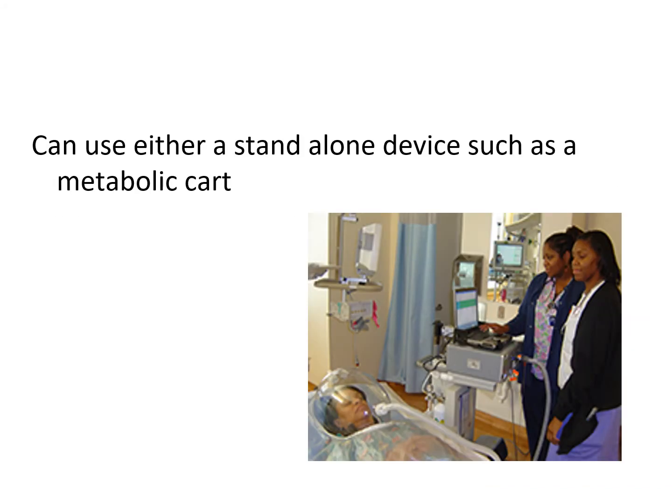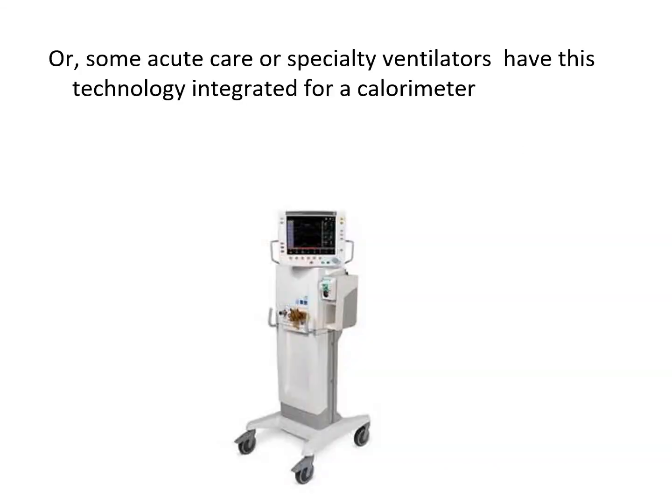So this is a picture of a metabolic cart, a standalone unit that they can use right at the bedside. They use a hood device to obtain those gas measurements. Some ventilators actually have a calorimeter built into their units.